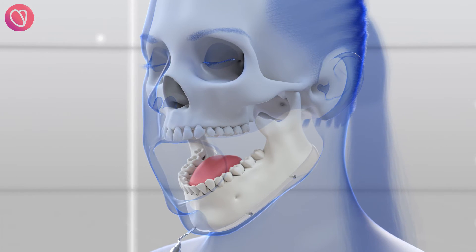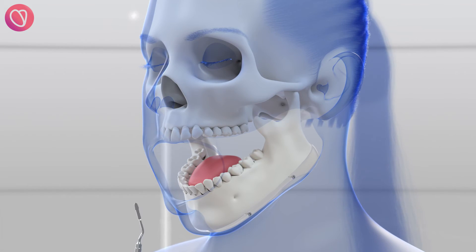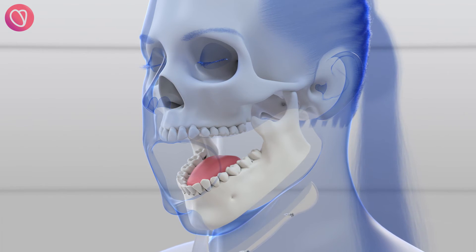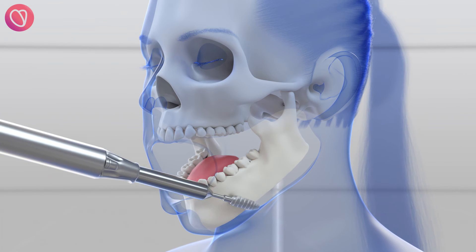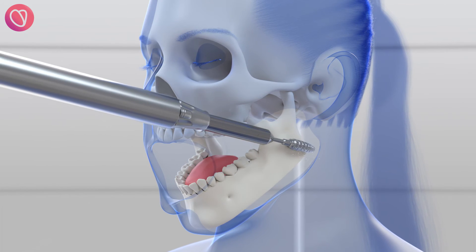Piezo surgery preserves surrounding soft tissues such as blood vessels, nerves, and muscle. The 3D cutting guide is removed together with the bone fragment. The high-speed burr is then used for the final shaving to leave the bone surface smooth.